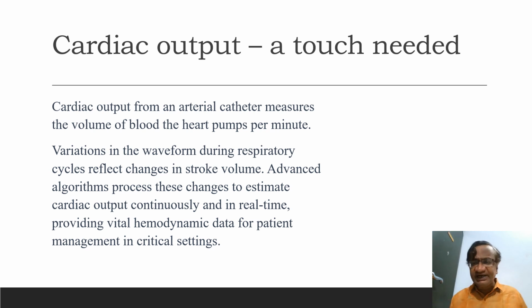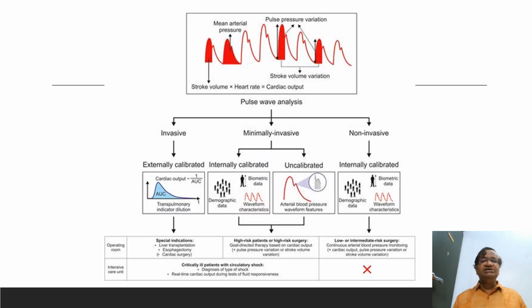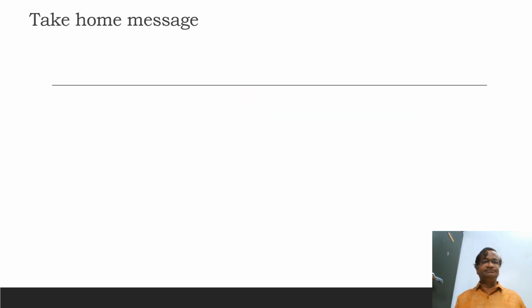Yes, cardiac output is needed, it's a separate topic. Variations in waveform during respiratory cycles reflect changes in stroke volume. There are so many algorithms we can make out. See here, invasive, minimally invasive, non-invasive, calibrated pulse wave analysis, and we get cardiac output monitoring.